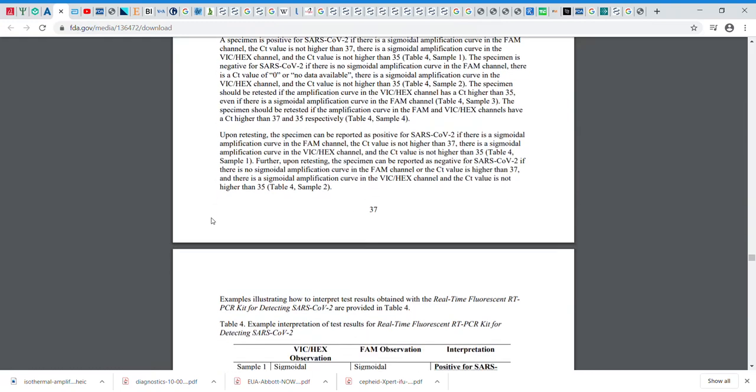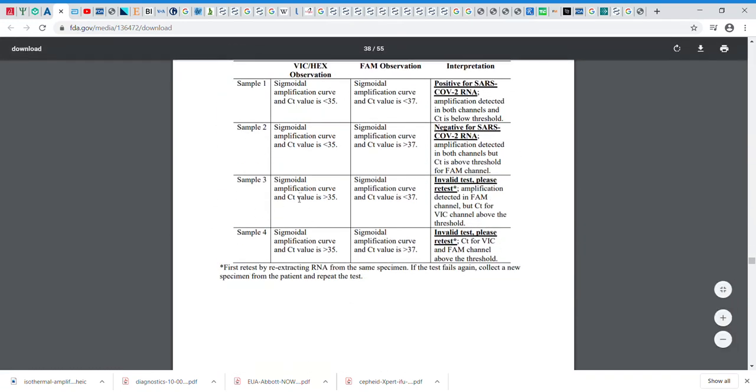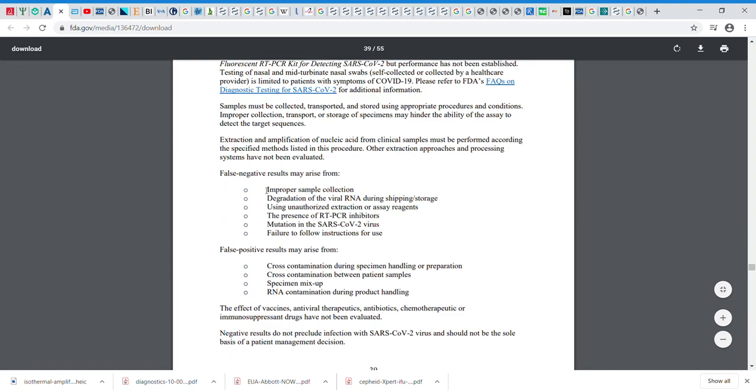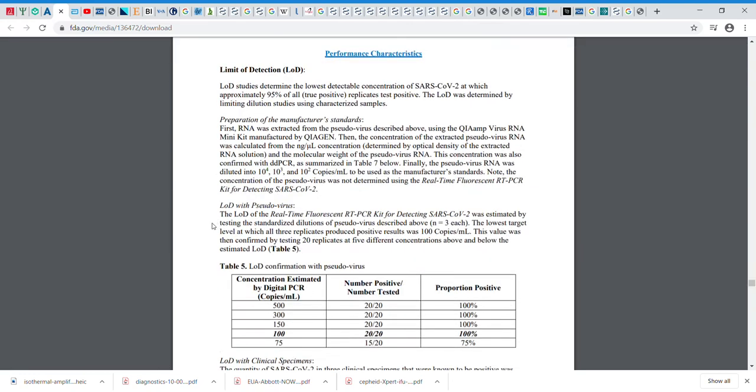And then they talk about how to interpret things. It's obviously very complicated. Look at the sigmoid amplification, the CT value. And then they go into a lot of detail about limitations. So, yeah, this is a pretty good test, obviously.